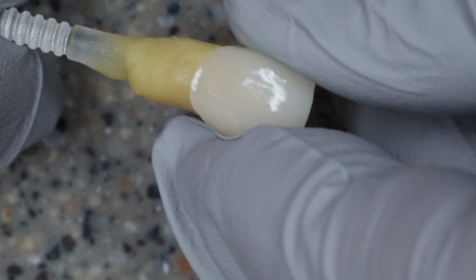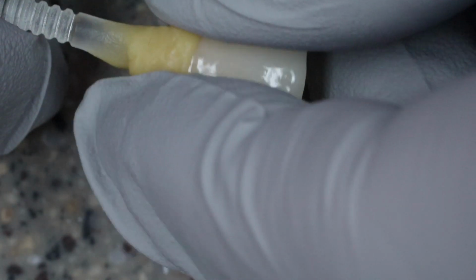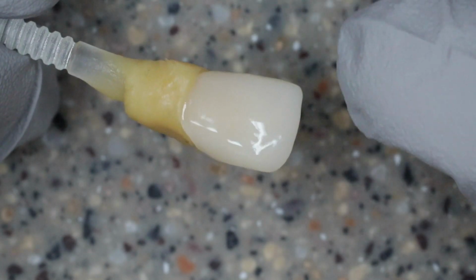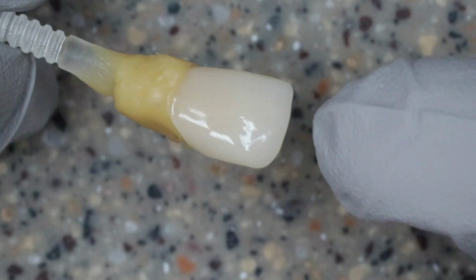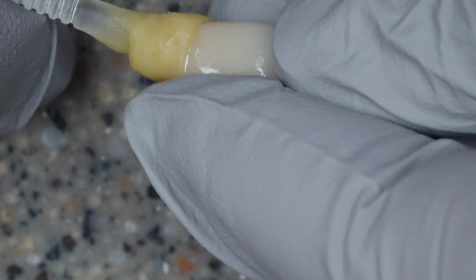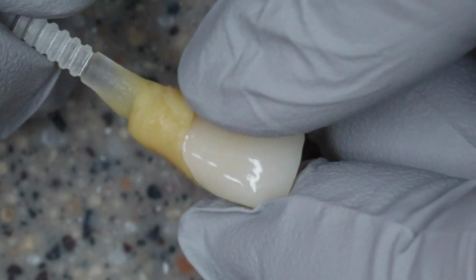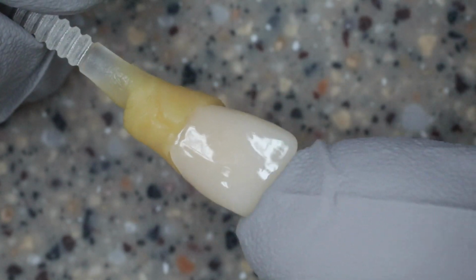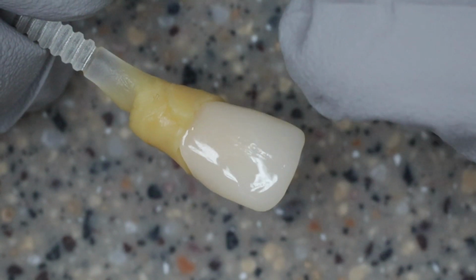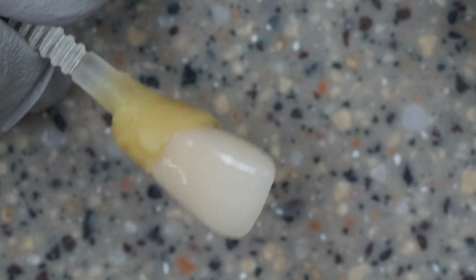And you can tell that this dye material does make a difference when it's on there. Now if you use an opaquing cement, the color of the prep, I should say, is going to be less important. But if you want to get some consistency in your restorations, one of the best things to do is to use this kind of material here to see what your crown's going to look like, and then just use a translucent cement. And that's going to give you a lot of consistency, because now your cement's not going to play a huge factor in the final outcome. It's going to look a lot like it does here.